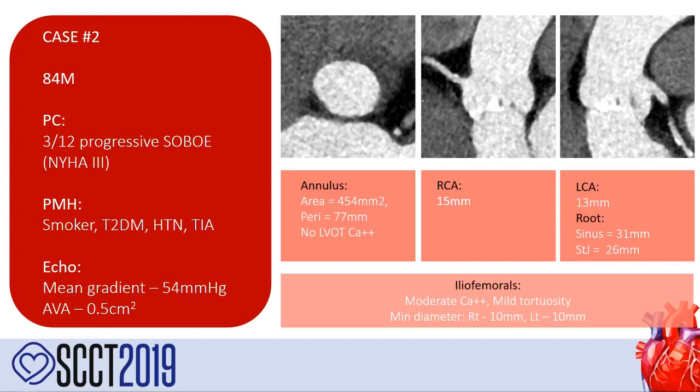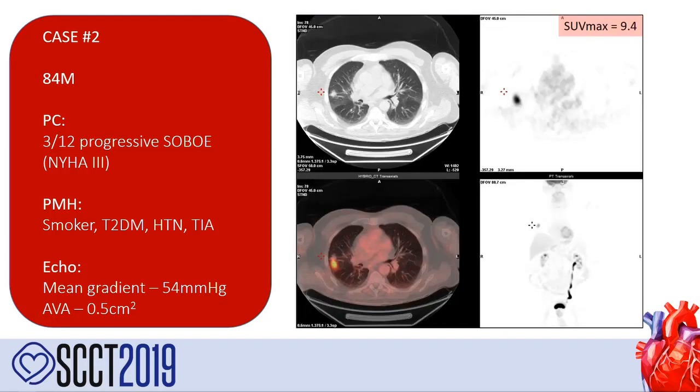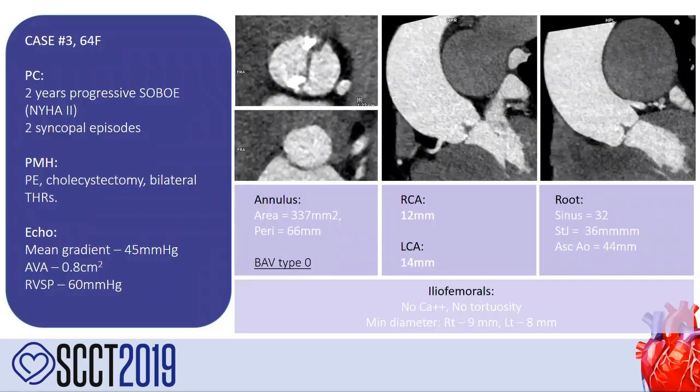So again, green light for a TAVI, except on the rest of the scan, this is what's there, and I don't need an arrow in this one to point out the large mass originating in the right lung. Now, this patient was rapidly triaged on for PET, which showed that this was a localized malignant tumor within the lung with no nodal and no distant metastasis, completely unknown up to this point. So once again, CTA saves the day, or has it? We'll come back to that.